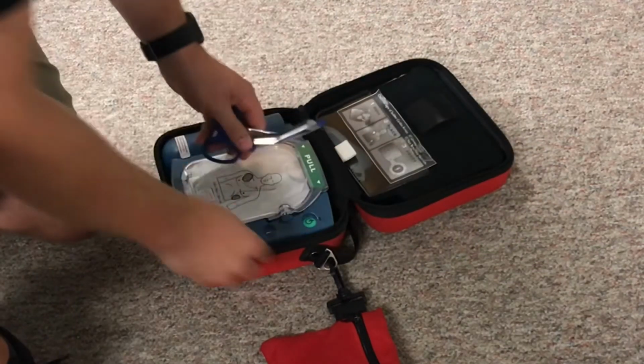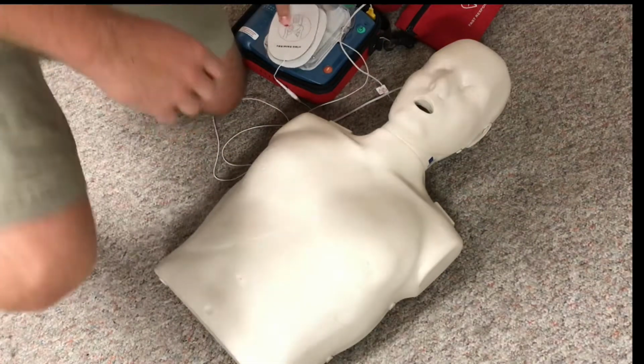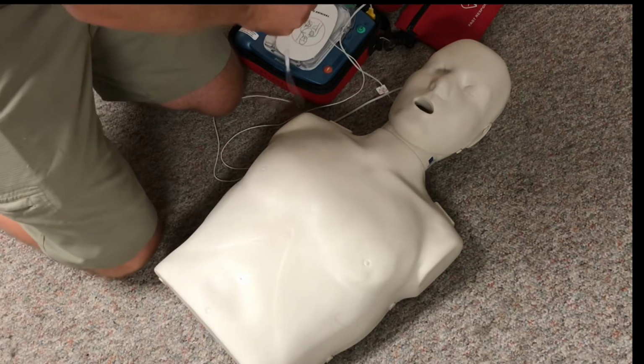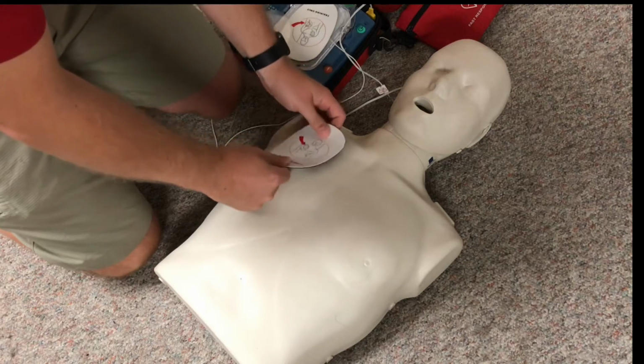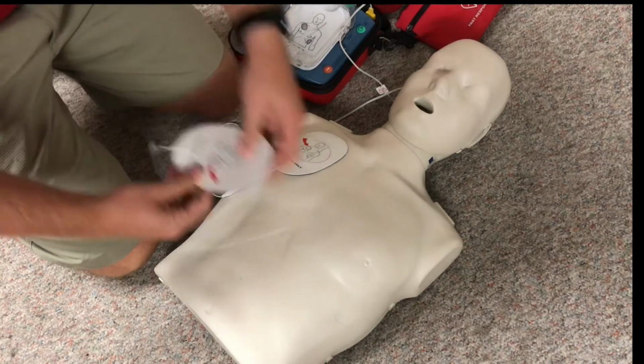Some AEDs have scissors to use to cut away the clothing. To apply the AED pads, follow the visual cues on each pad as a guide. Peel the plastic off and apply directly to the victim's skin. Follow the AED's instructions once the pads are in place.